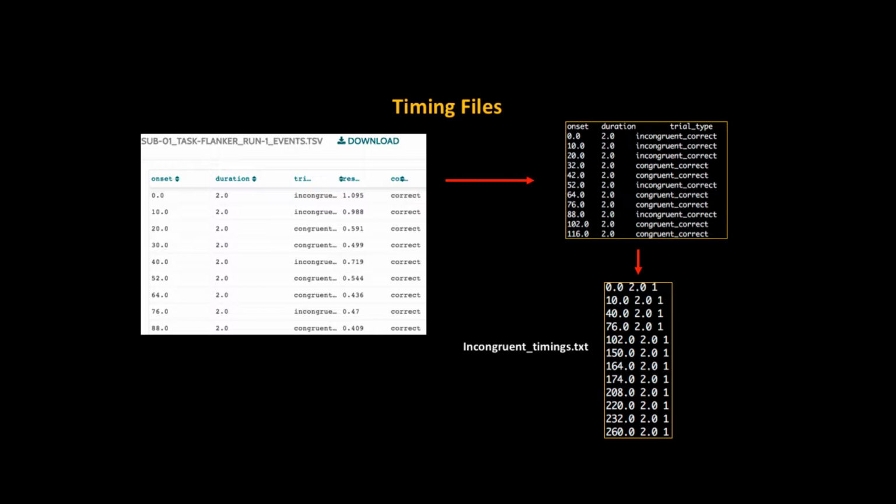So if your stimulus presentation software, ePrime, presentation, whatever, yeah, that's what I did. It's like, yeah, because there's absolutely nothing you can do to recover it. Right? If for some reason it didn't output it, we can't do anything. So always need to check it. Always need to make sure that it makes sense.